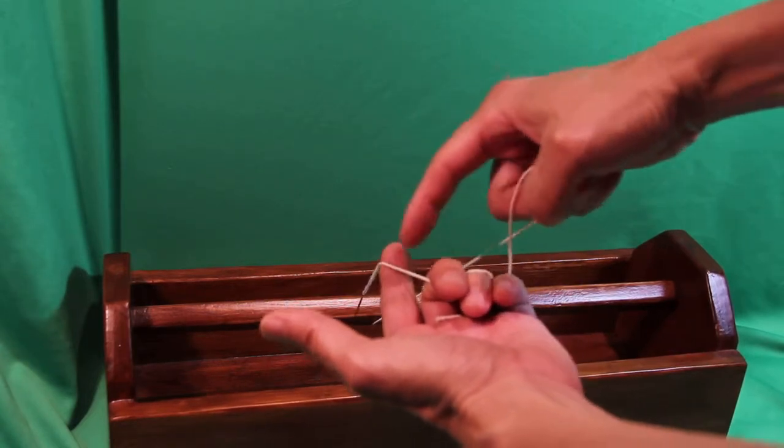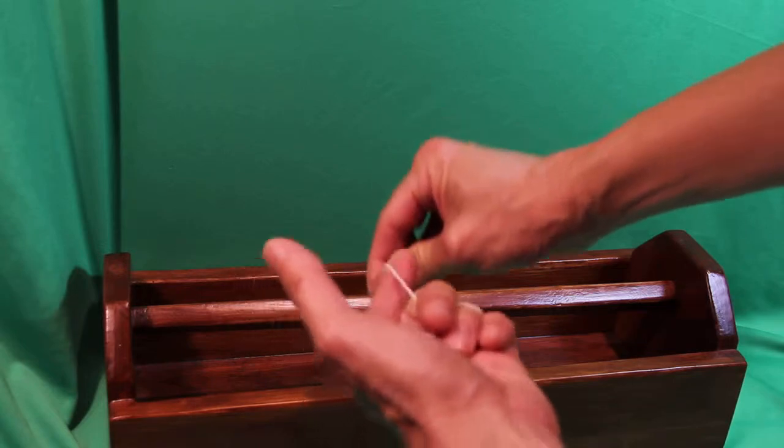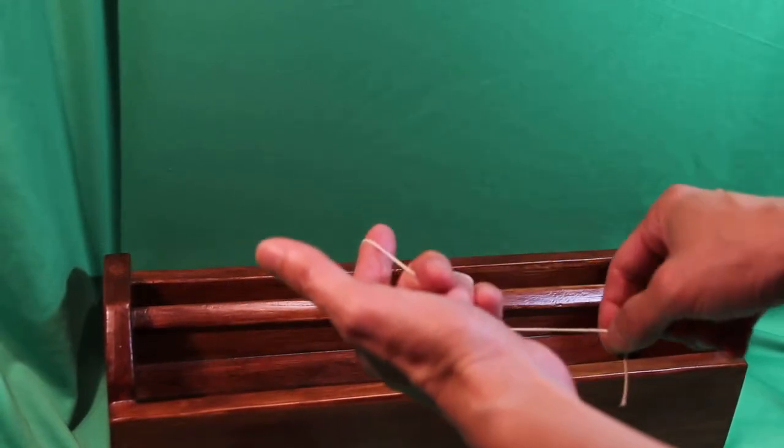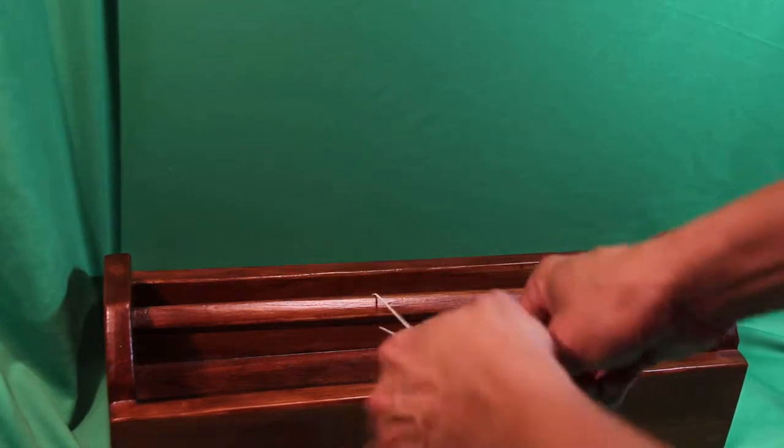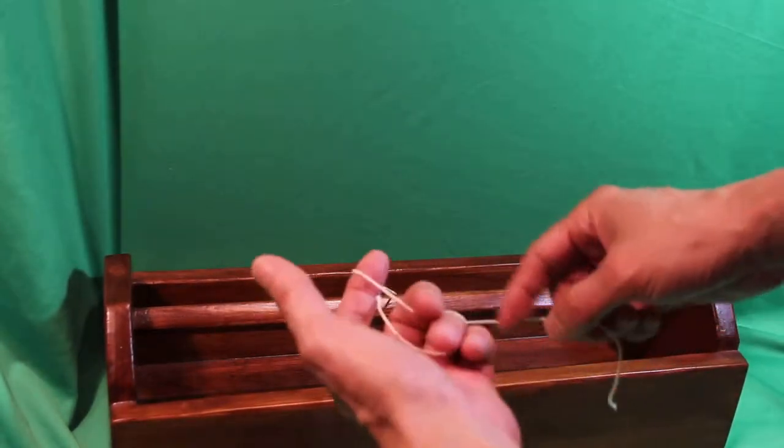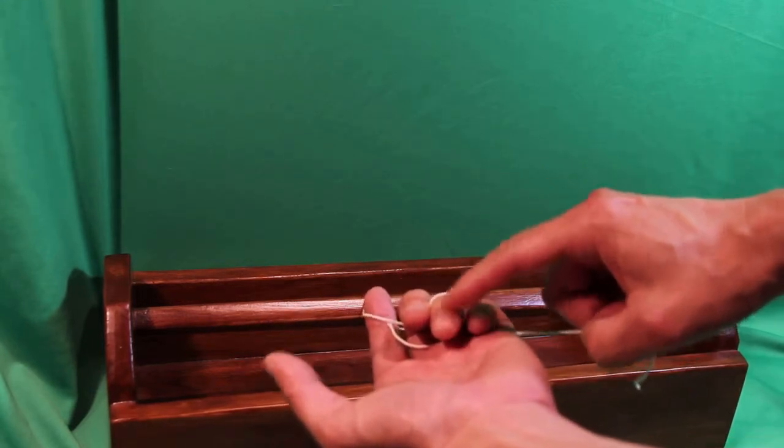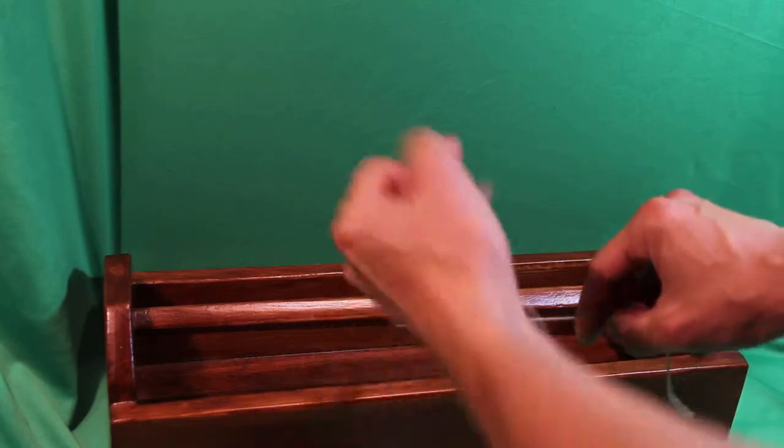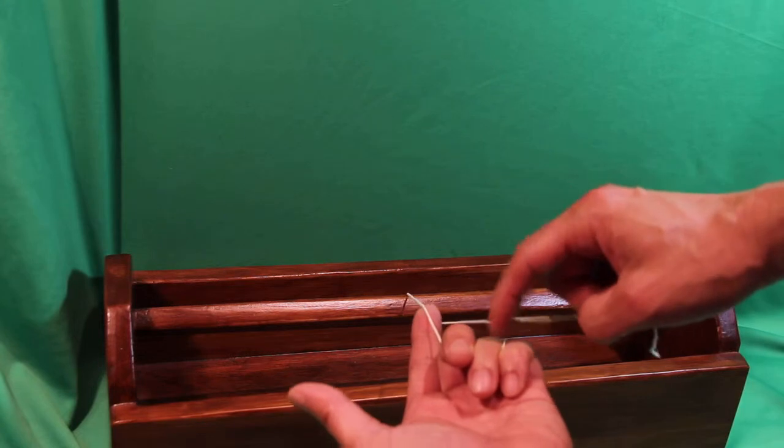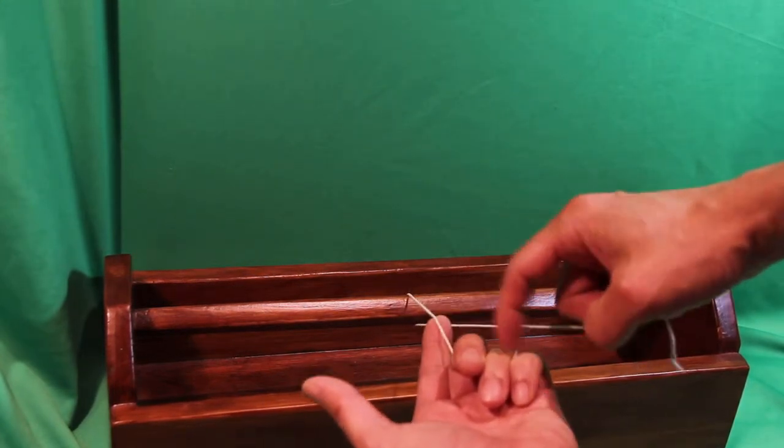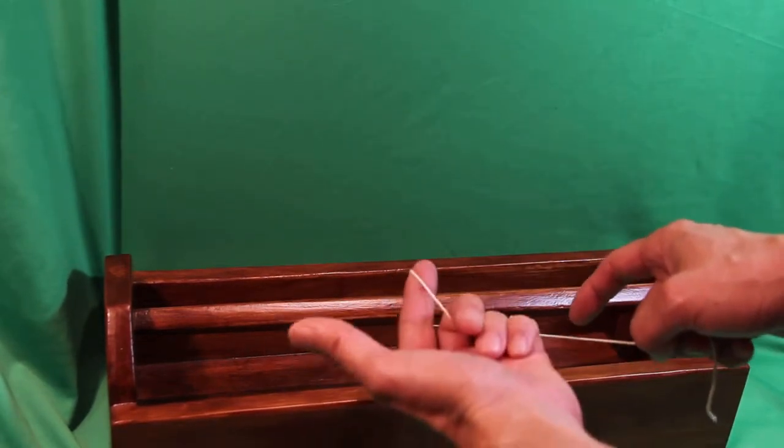However, these fingers have to hold the string tight so that the string doesn't move on your index. Your index has to be a stable point. Now you can grab the sutures like this and do it this way. Over time, you learn how to finagle the suture so that it goes around the dorsal part of your ring finger, under your middle finger, ideally something like this. So that you have a nice anchorage of the other end of the suture, of the strand, so that it's stable through your index finger. This is a very important point.